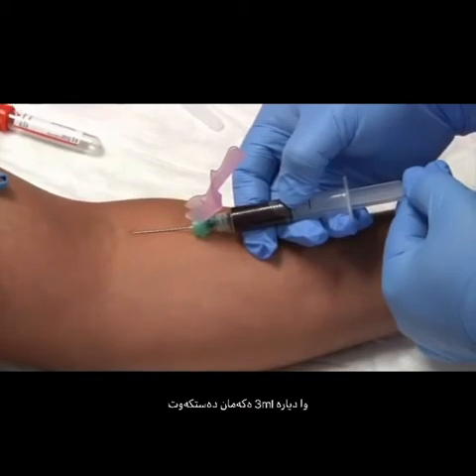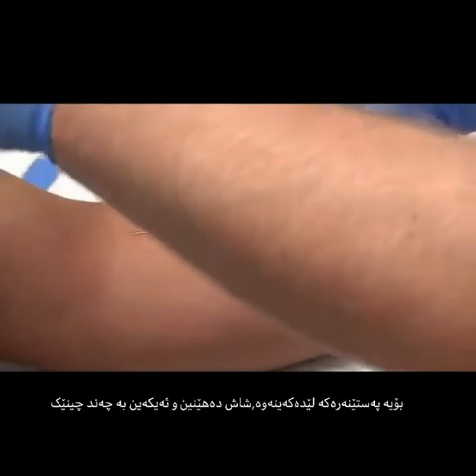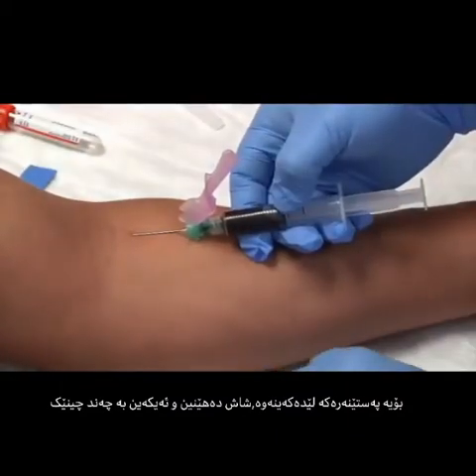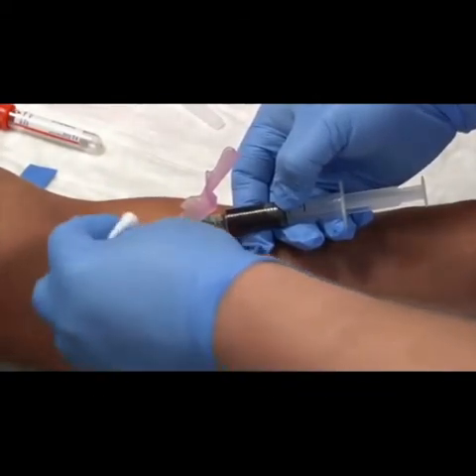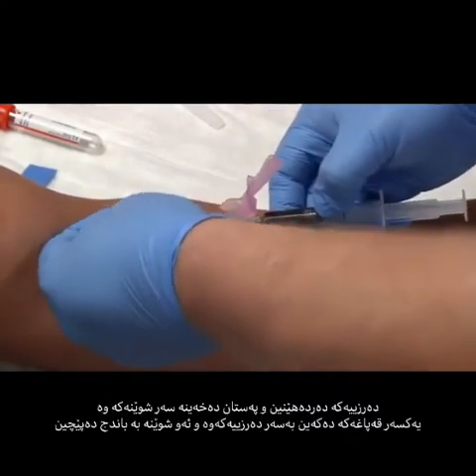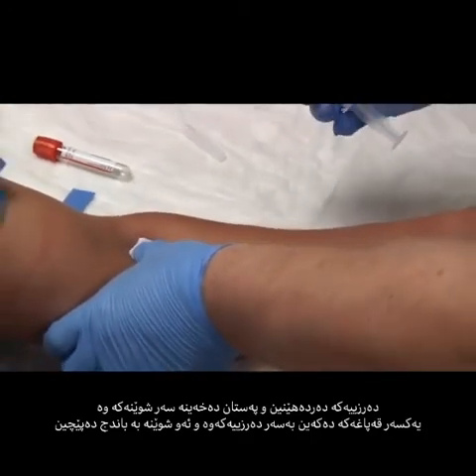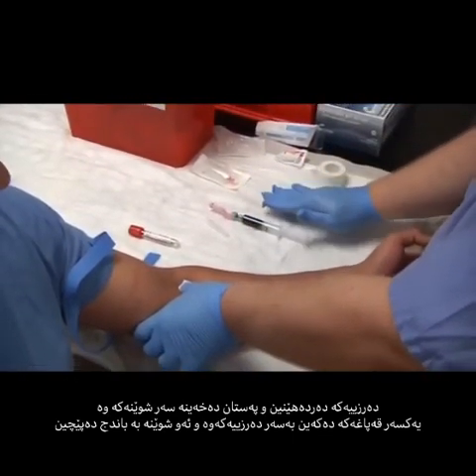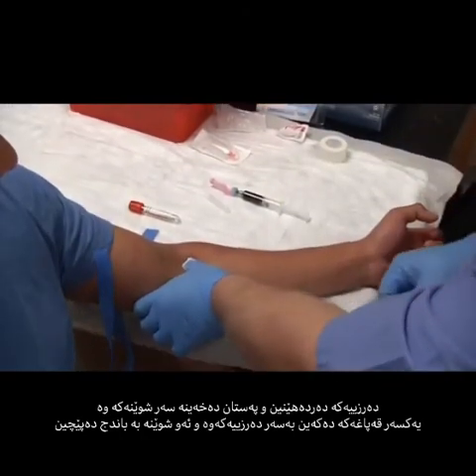Looks like I almost have my three milliliters of blood. I'm going to release my tourniquet, grab my gauze, fold it over once, fold it over twice, pull my needle out, apply pressure, and immediately safety cap. In this instance only, we can set the syringe down on our disposable chuck and finish bandaging our patient.